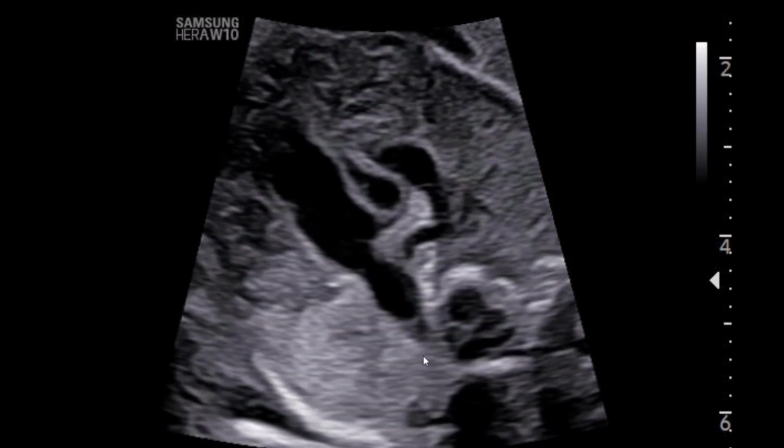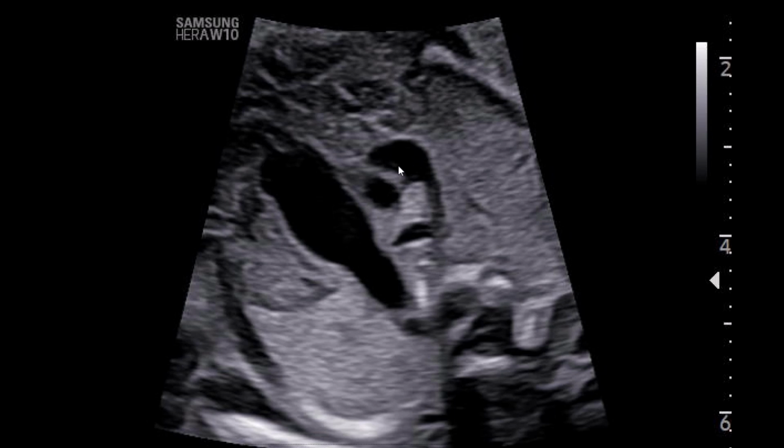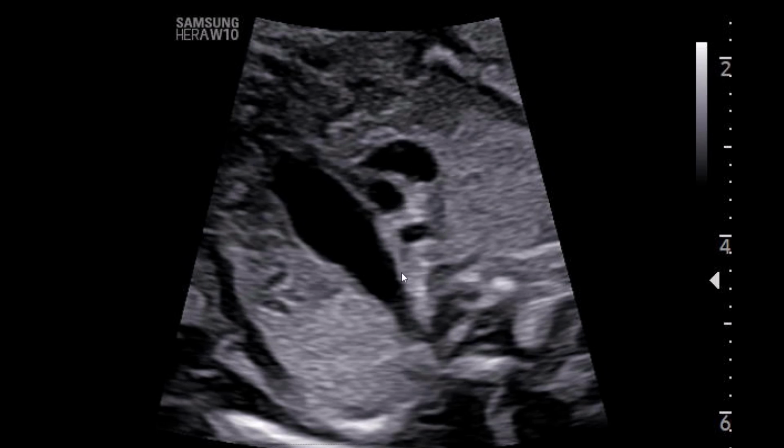Moving forward, three-vessel tracheal view, you have the three vessels, SVC, aorta, pulmonary artery, ductal arch, ductus arteriosus, and here's the trachea. And as we sweep more cephalad, you should see a V form.